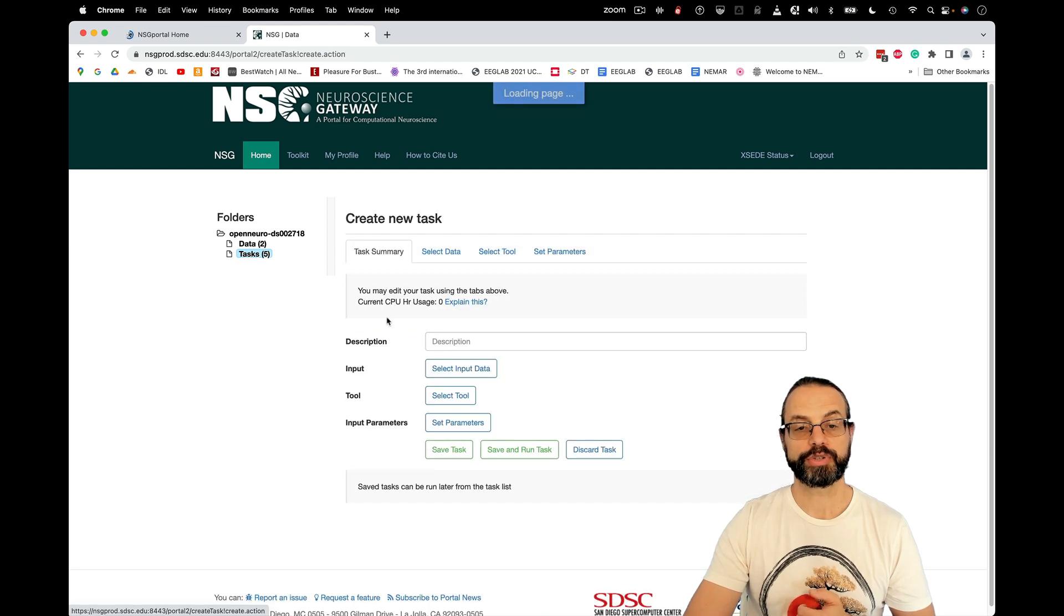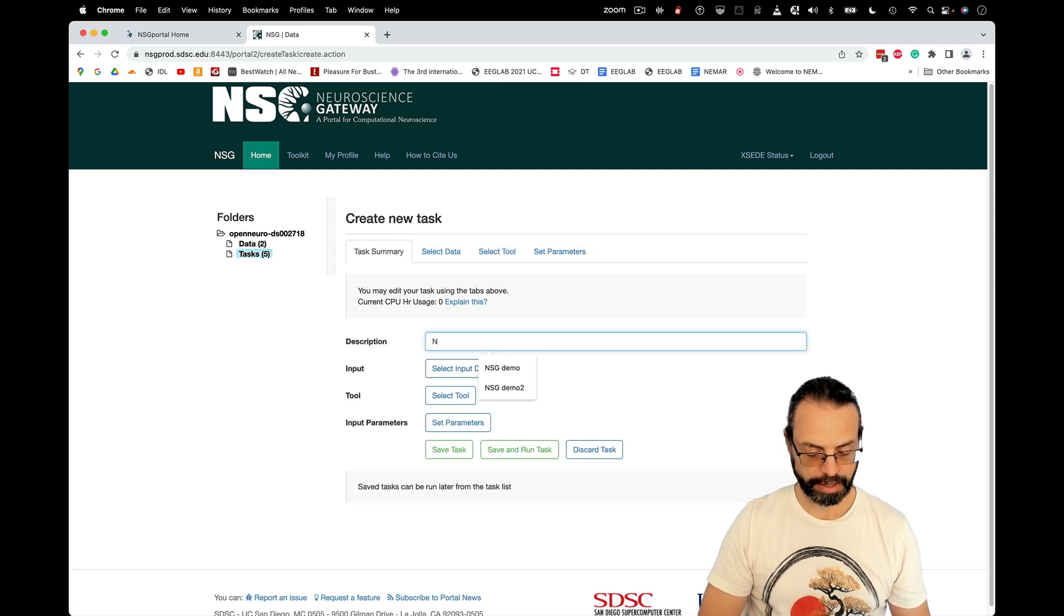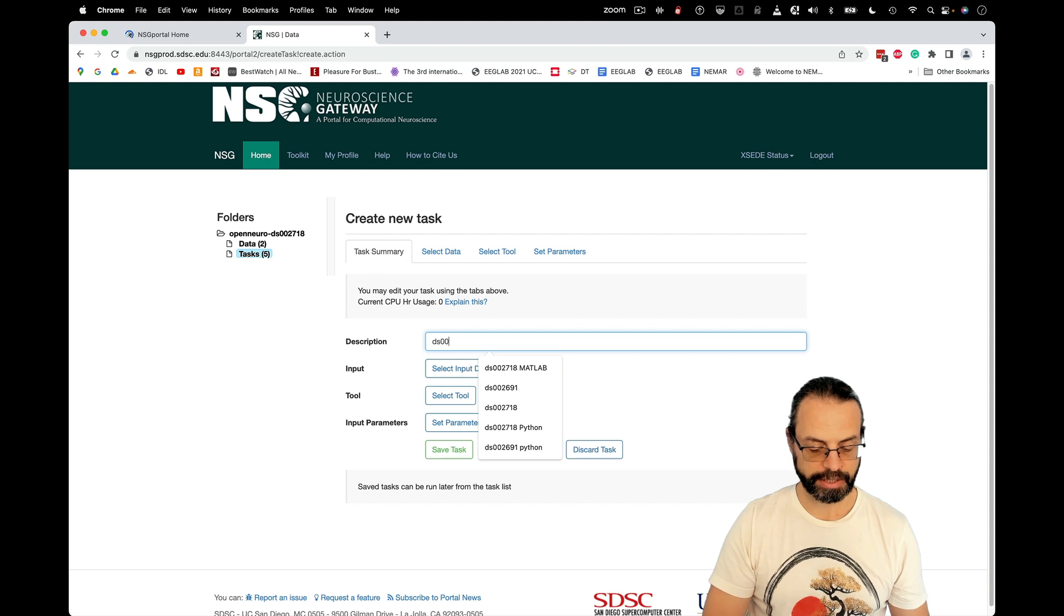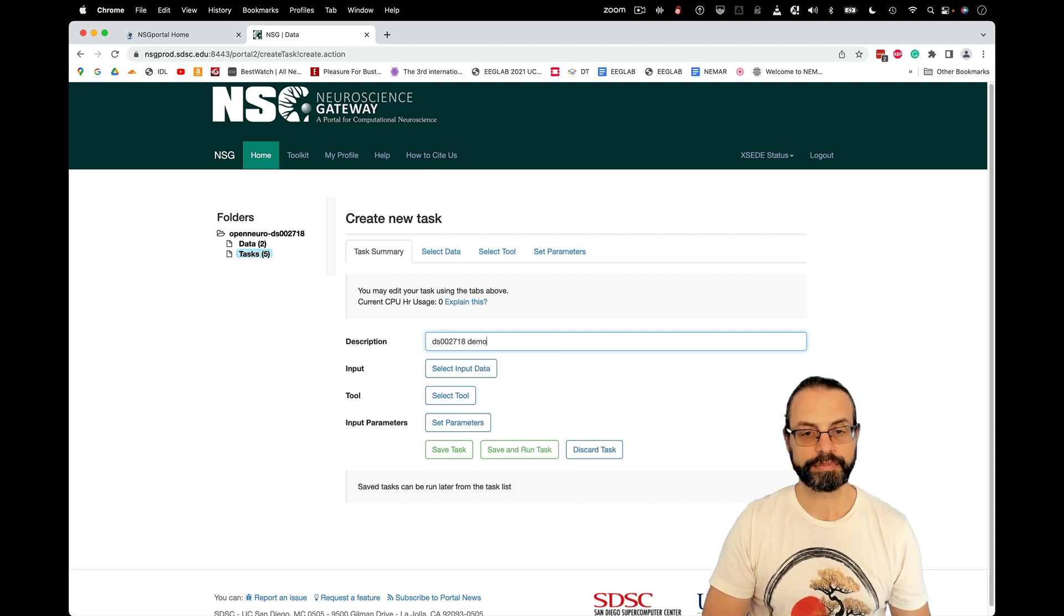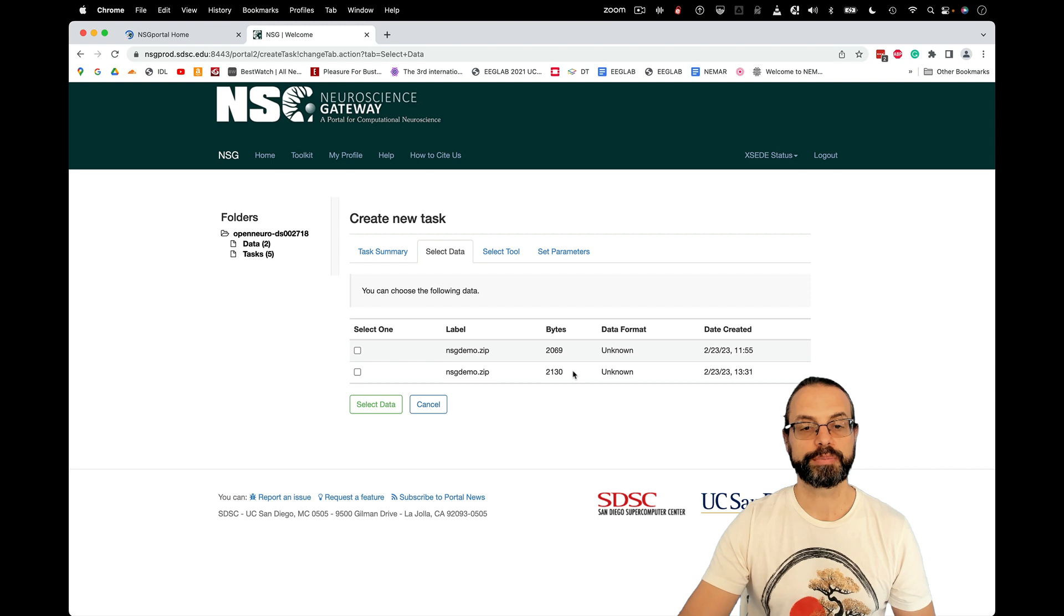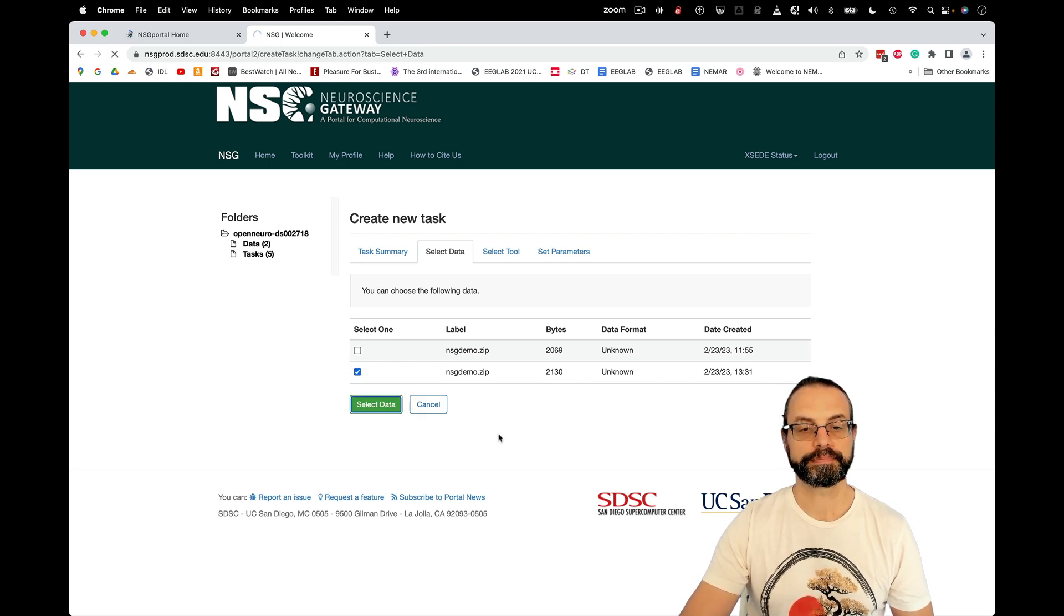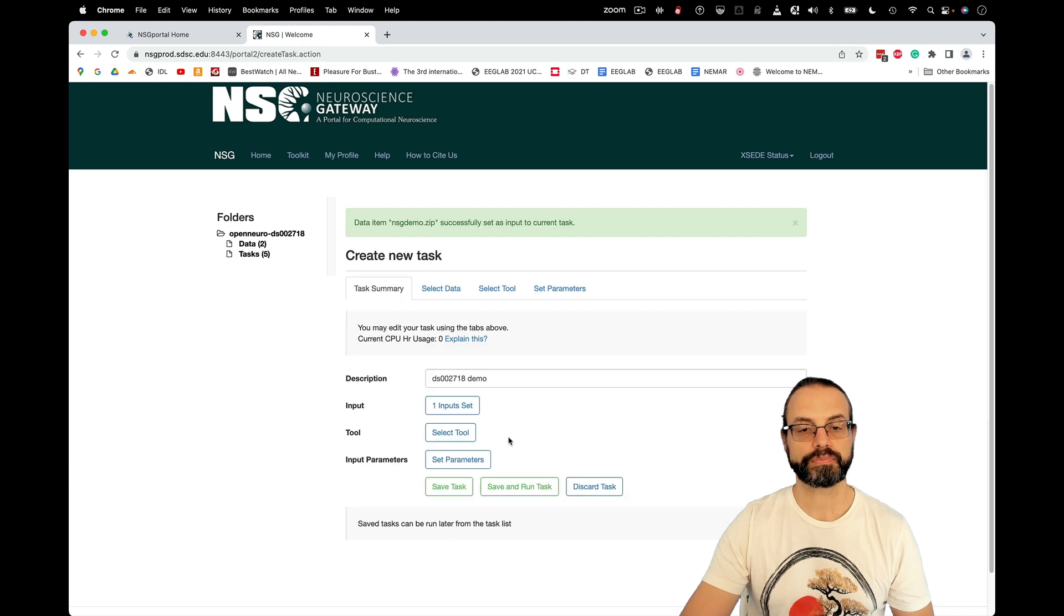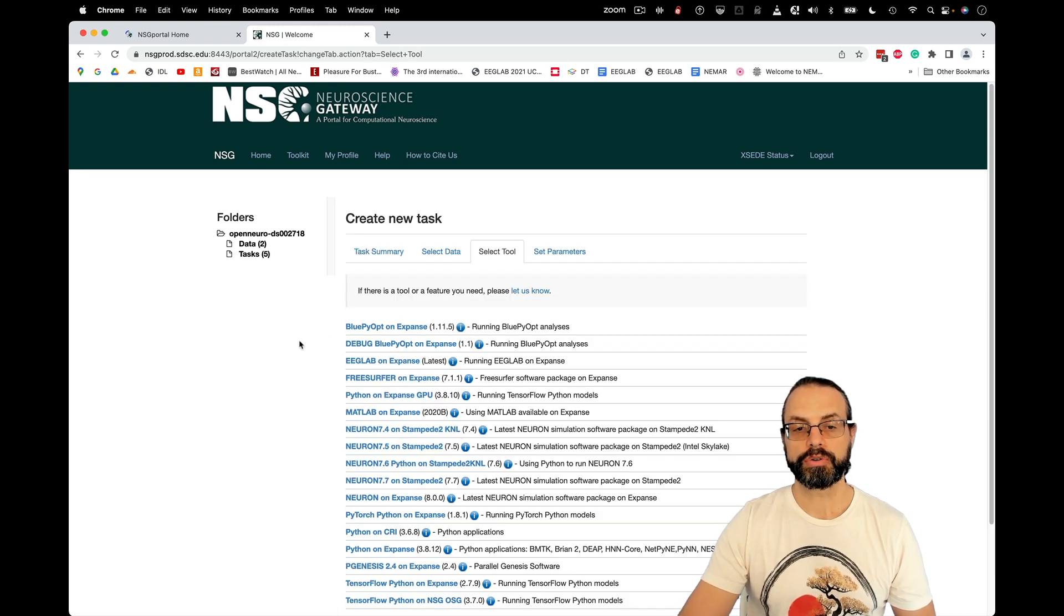So you're here, create a new task. I'm going to call it DS002718Demo. I'm going to select the input data. And so the one I just uploaded is this one.